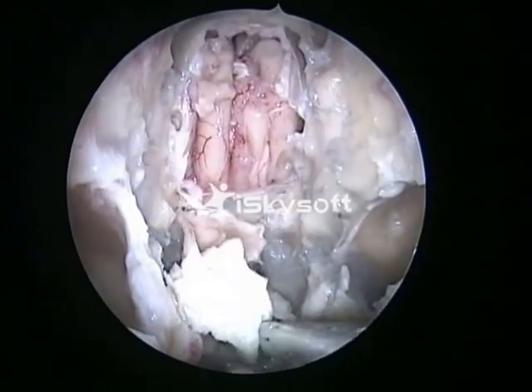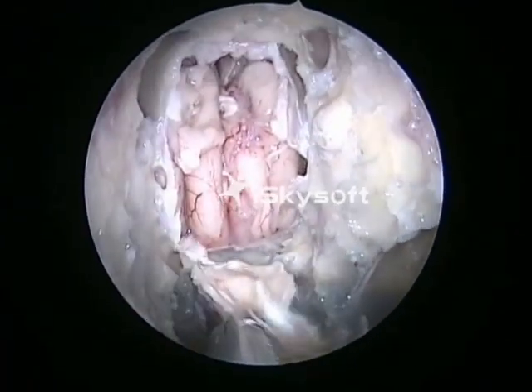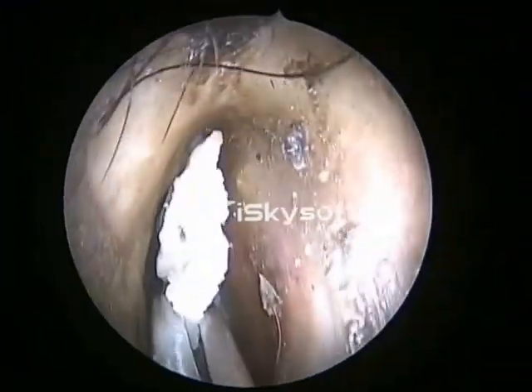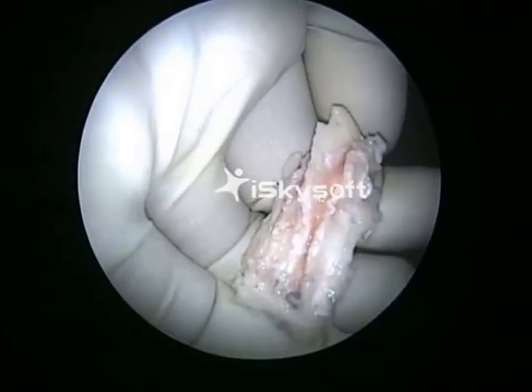That's the bone of the skull base being removed en bloc. That's the bone of the skull base, superior portion of the septum.